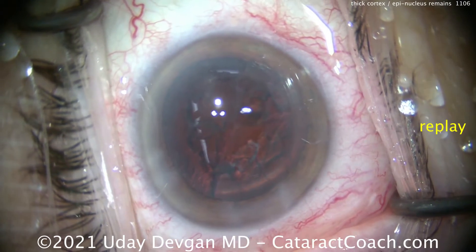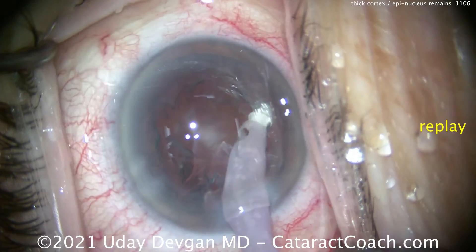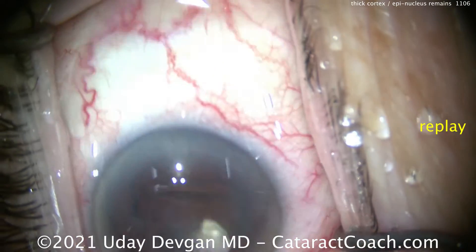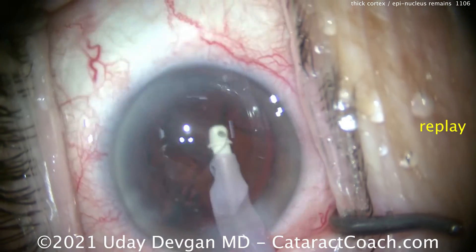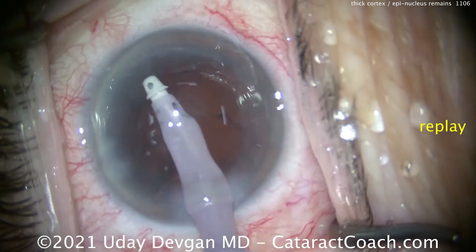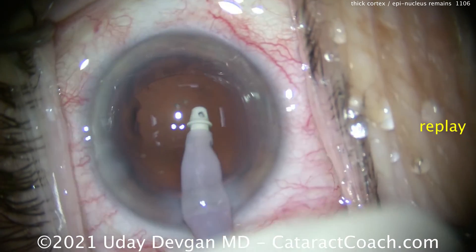Now let's watch that one more time. This is a replay of that cortex removal. The IA probe goes in the eye — look at the technique here. We want to grab it and get as much of it as we can, and then bring it centrally. I want to tease that cortex or that epinuclear shell away. There's a lot of movement — look at the eye movement back and forth. Going in all quadrants, we really want to keep this as one big sheet and then aspirate it down.